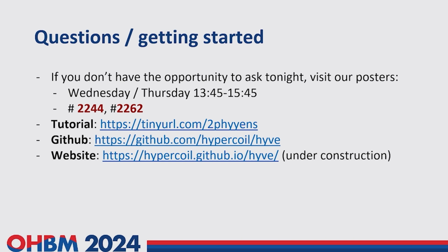Okay, we have another question. Does Hyve solve some of the performance problems of plotting in Nilearn? So in terms of 3D visualization, the back end for Nilearn is often matplotlib for some of these 3D visualizations. In that case, yes, this is built on PyVista and VTK underneath, which could potentially even be GPU accelerated, depending on the way you build the library. It will, for those 3D visualizations, be more performant in general.